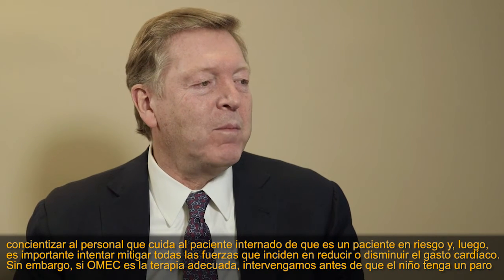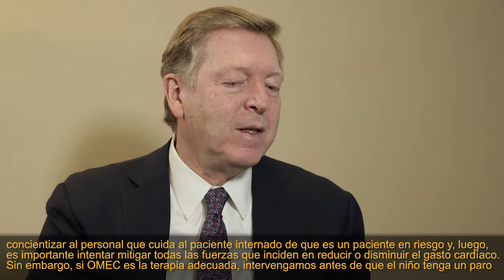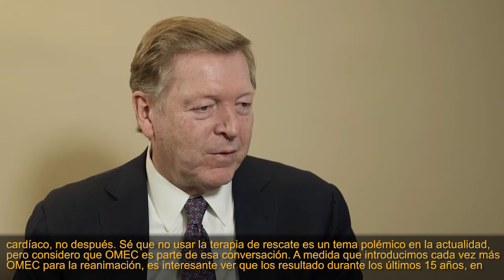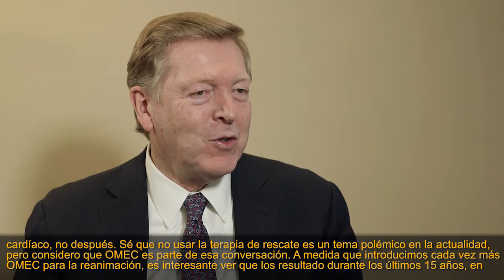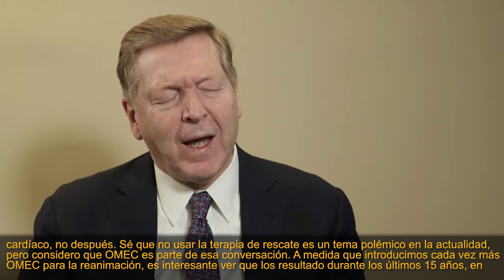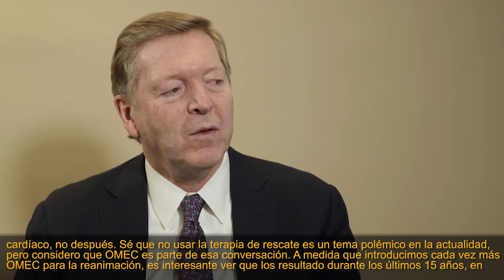However, if ECMO is the right therapy, then let's intervene before the child has a cardiac arrest, not after. So failure to rescue is a hot topic, I know, these days, but I'm seeing ECMO as part of that conversation.